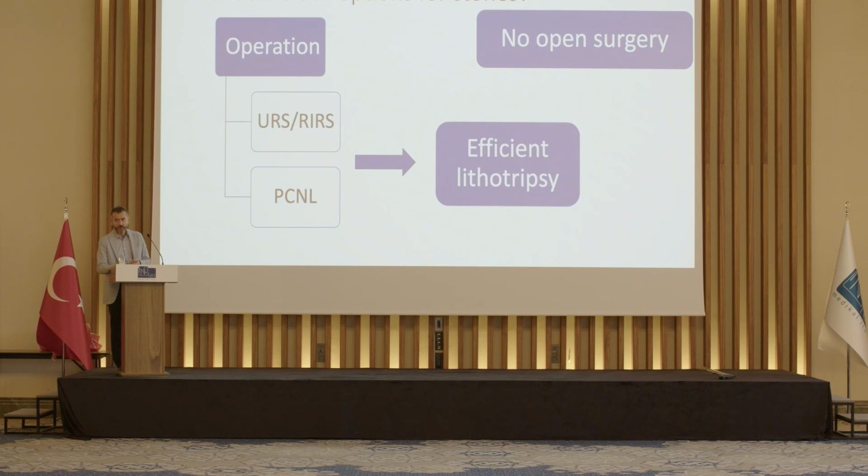So we no longer do any open surgery for stone cases. We mainly do endoluminal endourology through the natural orifices or with the percutaneous approach, and very rarely, if you need a reconstruction of the urinary system, we apply laparoscopy or robot-assisted surgery for the stones as well.